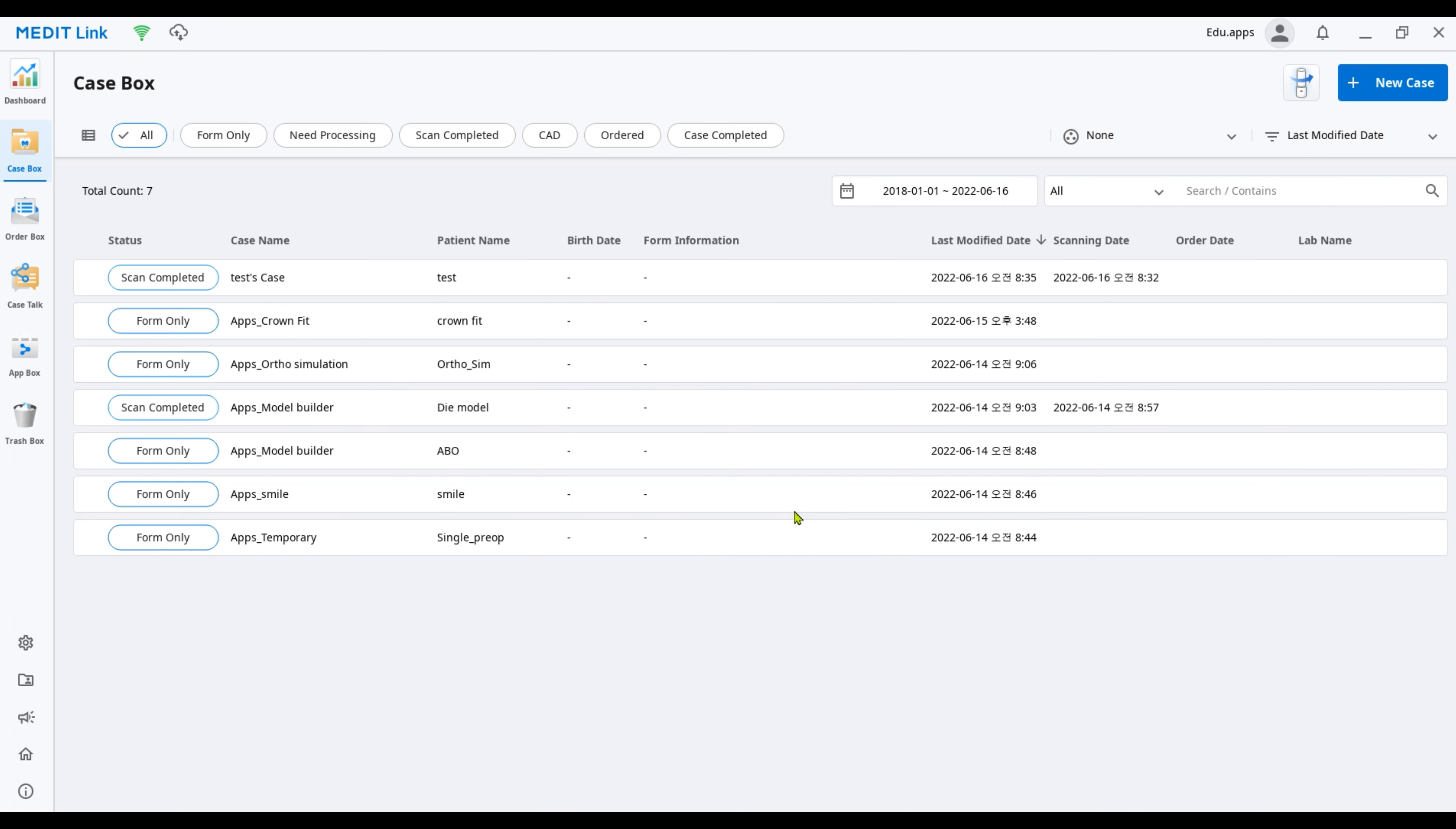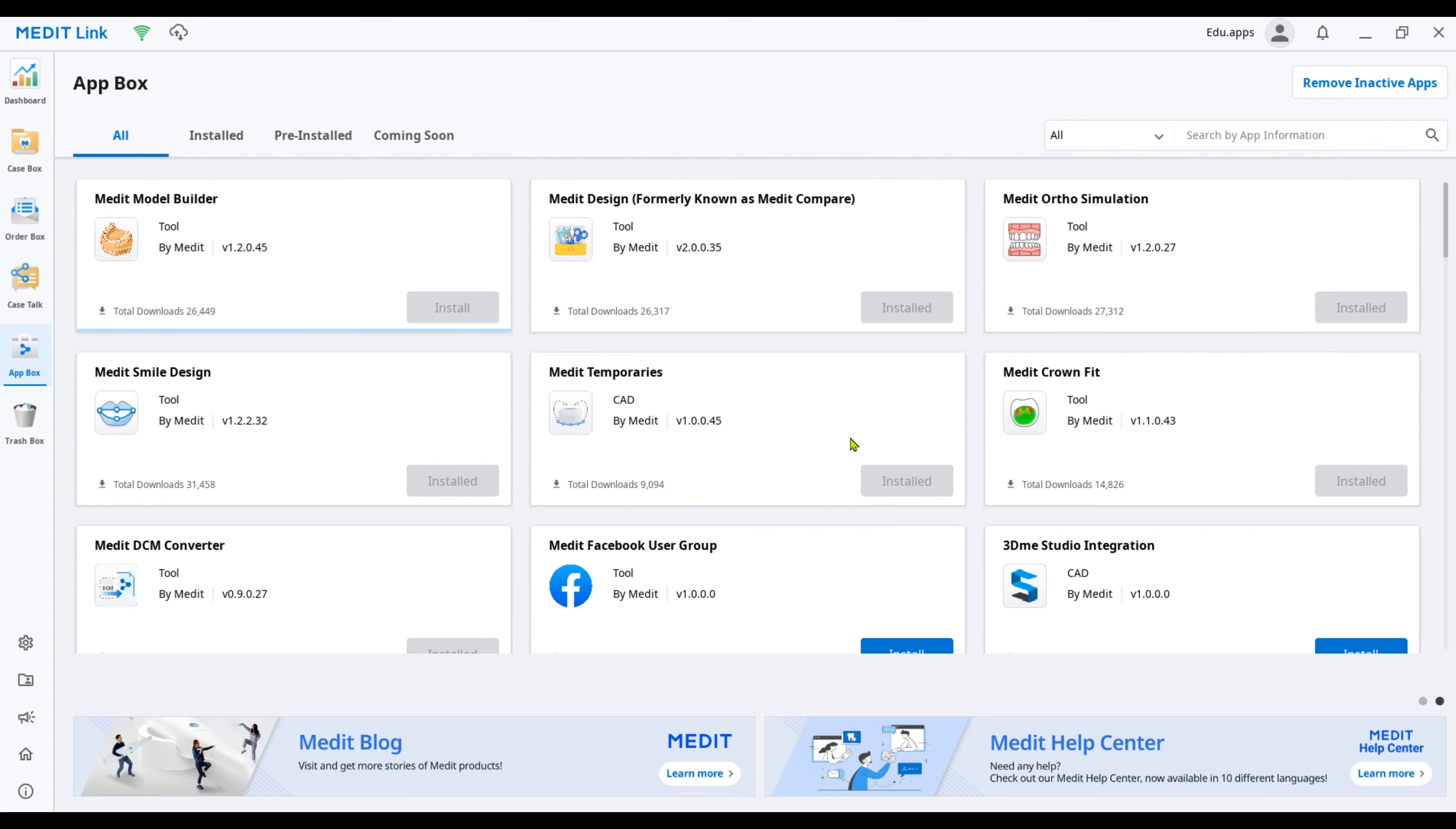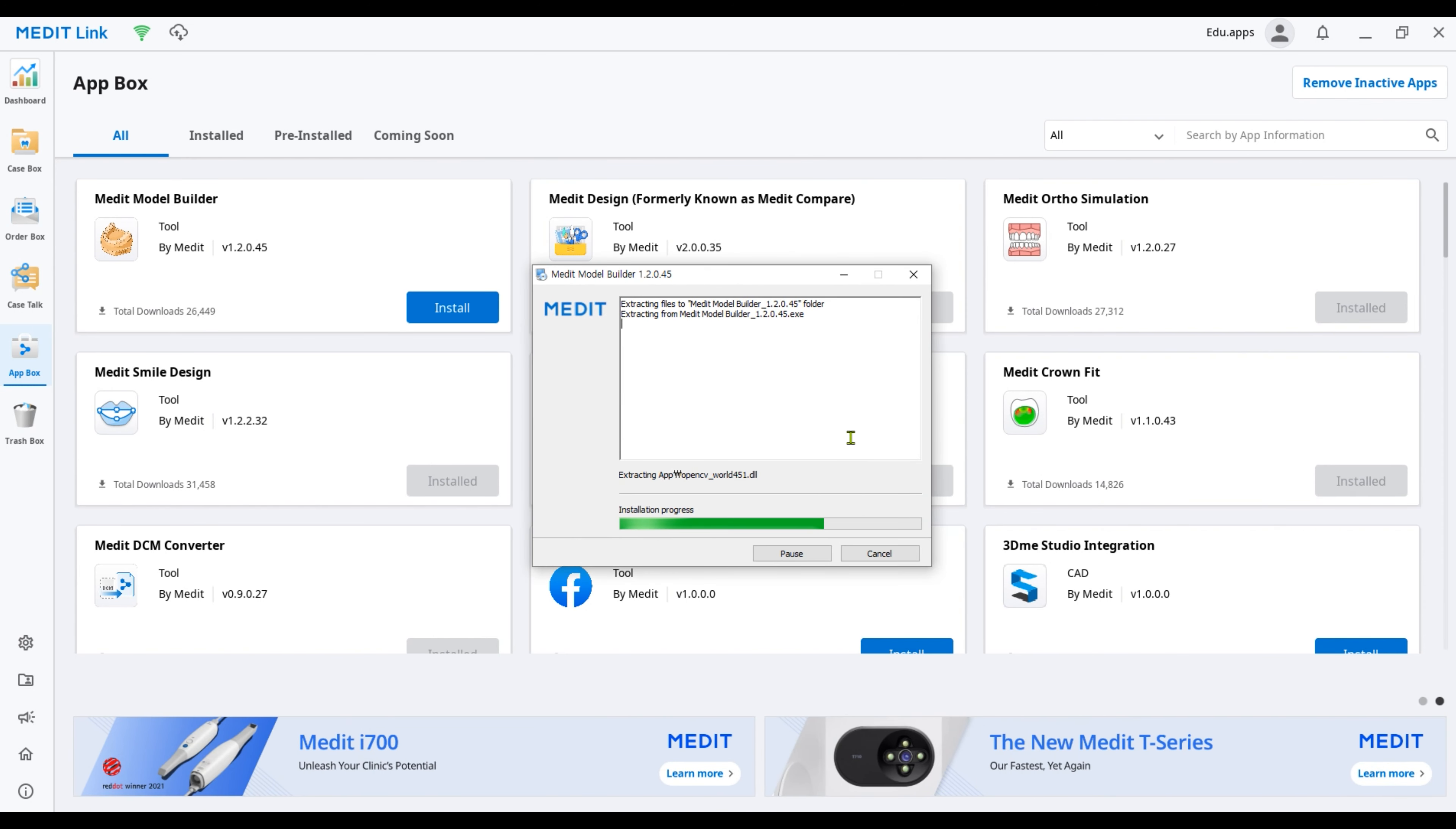Log in to your MeditLink account and go to App Box, then find Model Builder and click Install. The installer will run automatically.